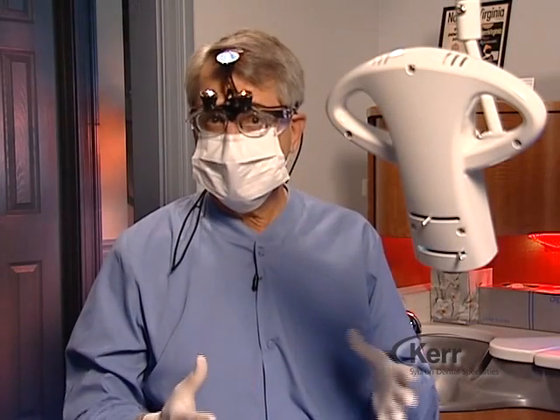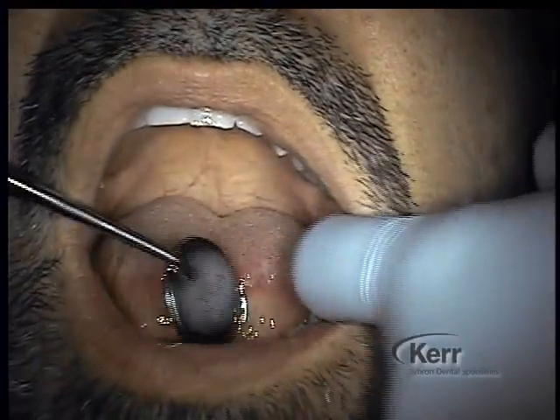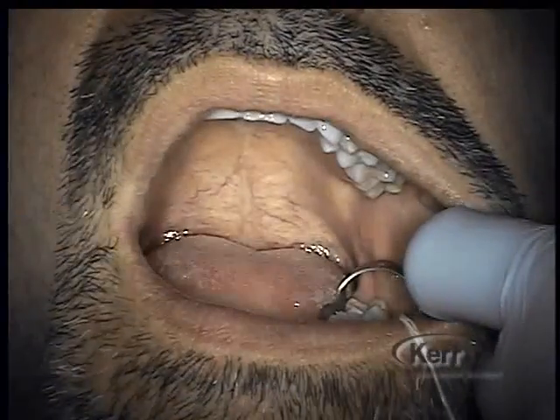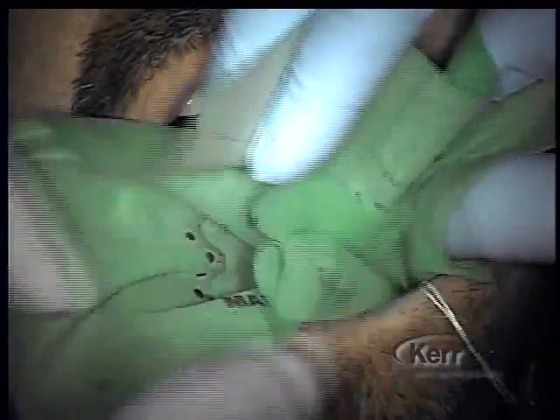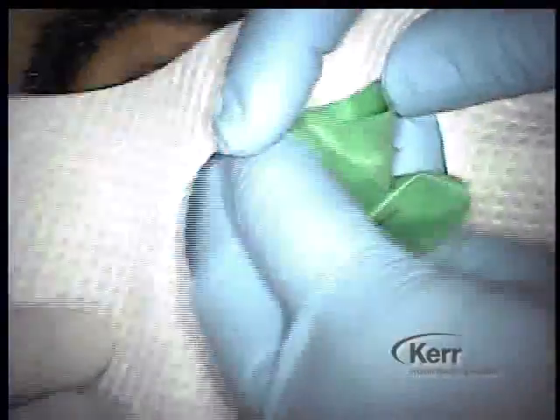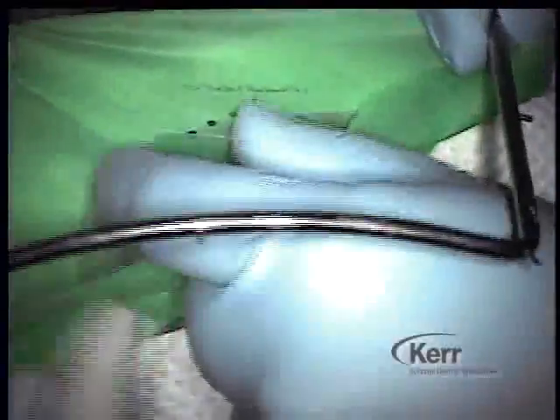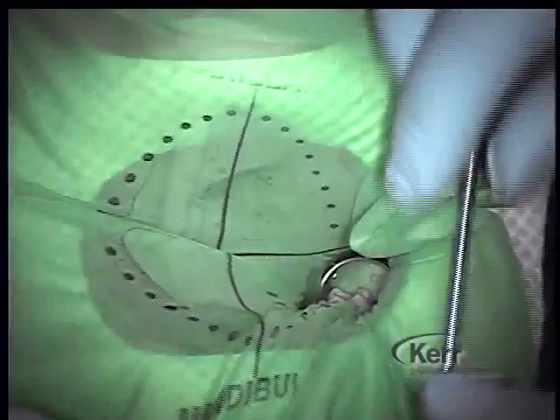The first step is to gain proper isolation, and my preference is the rubber dam. There is no better way of total isolation than utilizing the rubber dam. I will isolate the entire quadrant — even though working on a single tooth in the middle of the quadrant — going from the last tooth in the arch up to the midline. We'll place a bite block for the patient's comfort and a napkin. By going from the very last tooth up to the midline, it gives us tremendous access, opening everything up visually and for instrumentation.